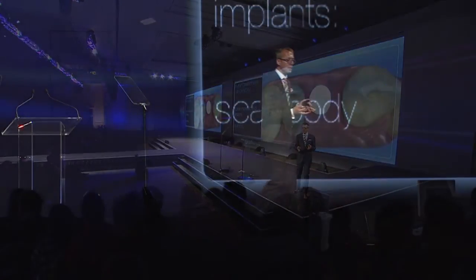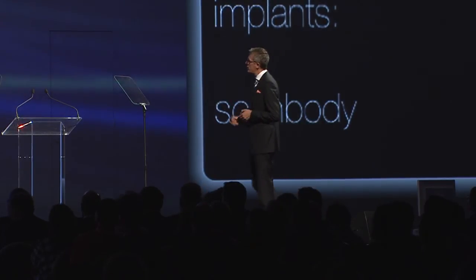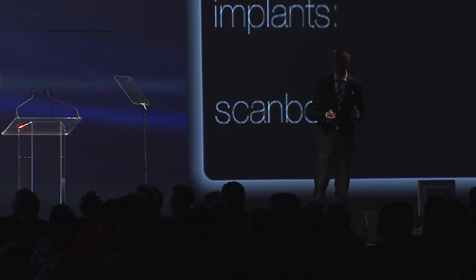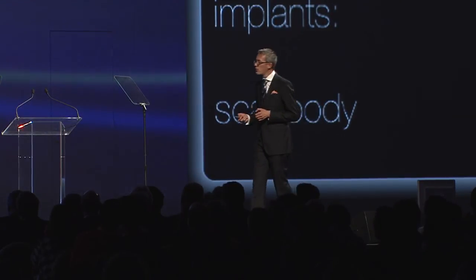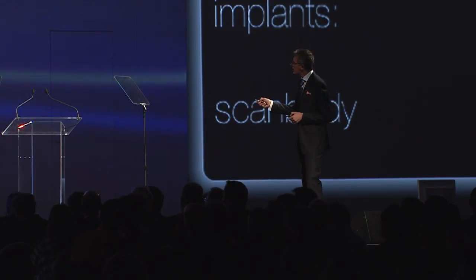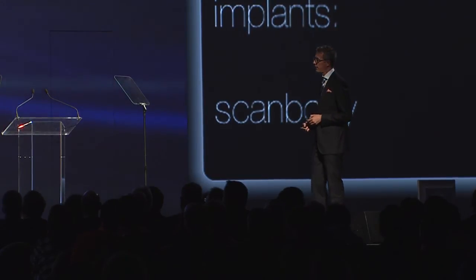At the moment we can only scan preparations, but in the future, in this one patient situation, we can also use an intraoral scan body. We can place the scan body intraorally. There will be scan bodies for intraoral use in the future, and then again we can use our OmniCam to scan this scan body in order to find out where the implant is located.